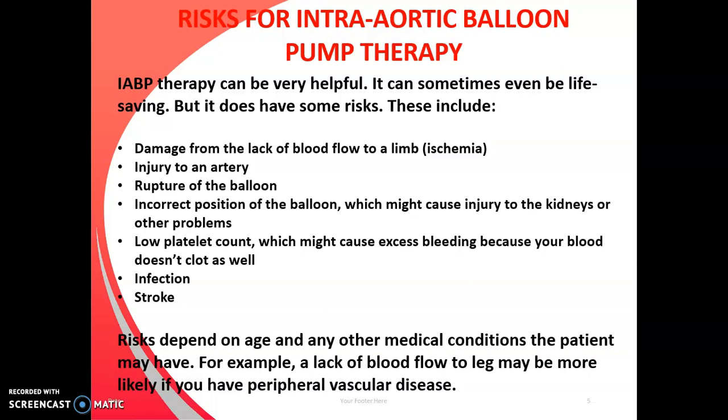Strict aseptic technique has to be followed during the procedure, otherwise there is always a risk of infection. Rarely, the procedure may lead to stroke in some patients. Risks depend on age and any other medical conditions the patient may have. For example, a lack of blood flow to the leg may be more likely if you have peripheral vascular disease.